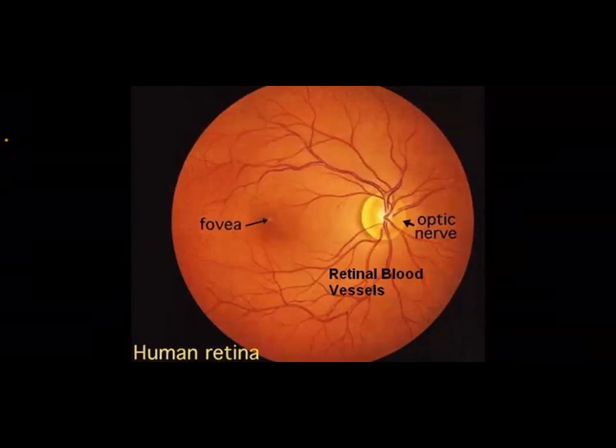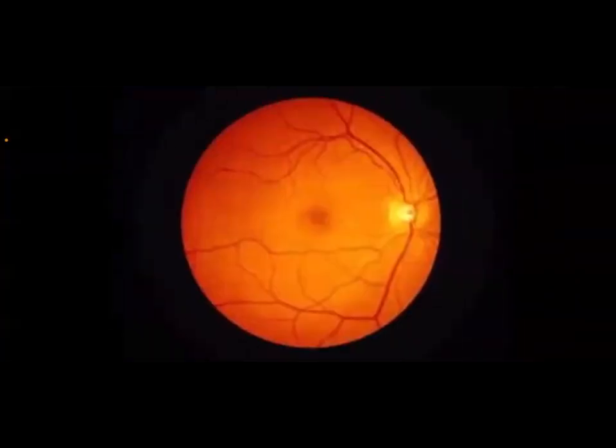Now your diagnosis is optic atrophy, especially if you have got a positive Marcus Gunn pupillary sign. This is the first diagnosis we got here in our fundoscopic examination. So how will you know that there is optic atrophy? All the borders will be clear and sharp, and the optic disc will appear just like the moon. I will show you.